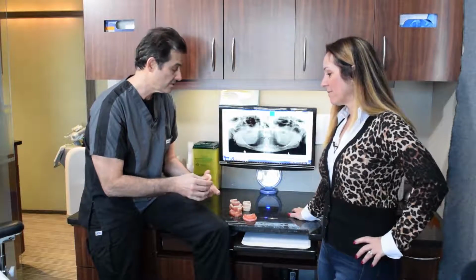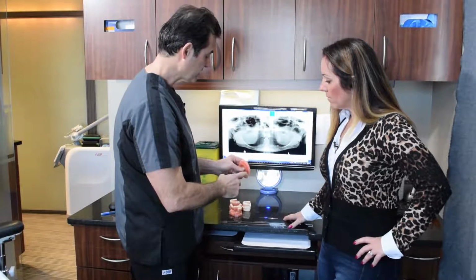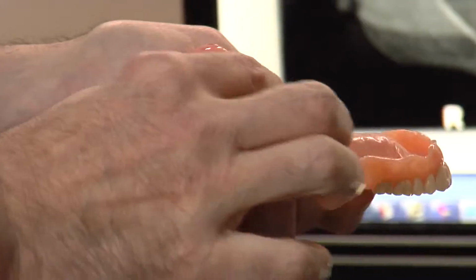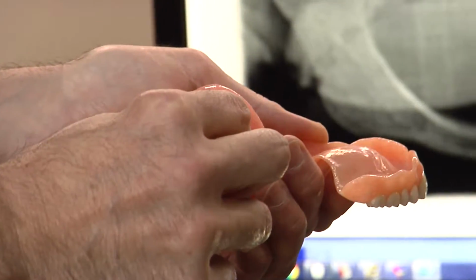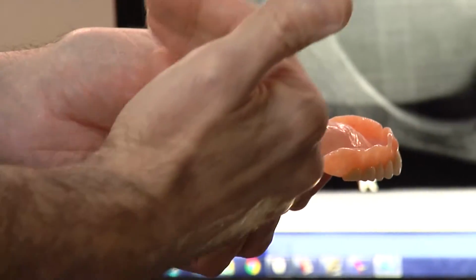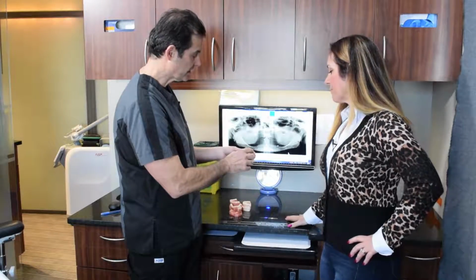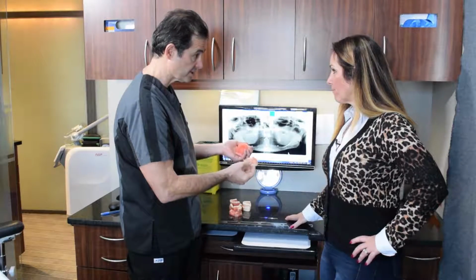In a previous video, we discussed how, over time, the jawbone is going to continue to shrink. And so what happens is that with time, your denture gets looser and looser. As you lose this tissue, we call this your pink tissue, so it's your gums and your bone, and as your bone shrinks and your gums shrink, then we have to add that missing pink that you're losing to your denture. So the denture gets thicker and thicker, your gums get shorter and shorter, and eventually you're not able to function and wear your denture.